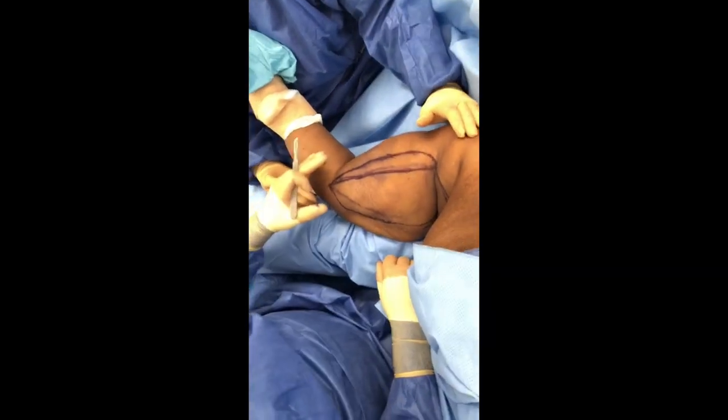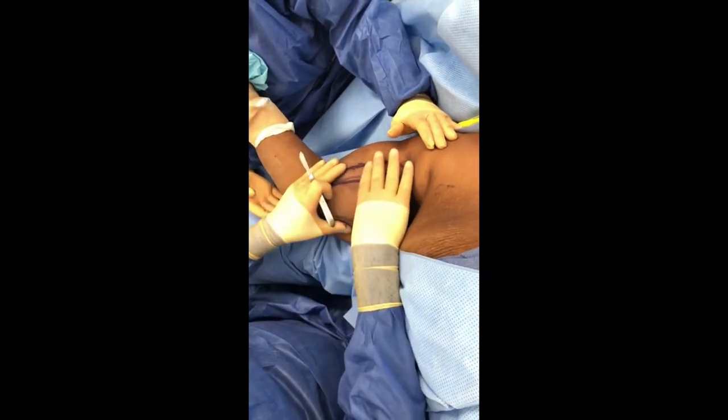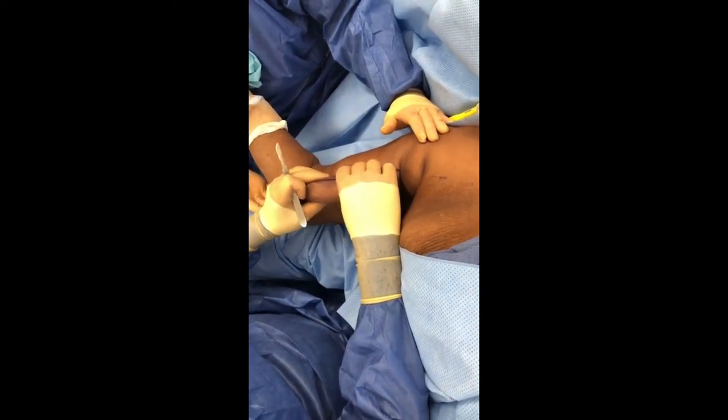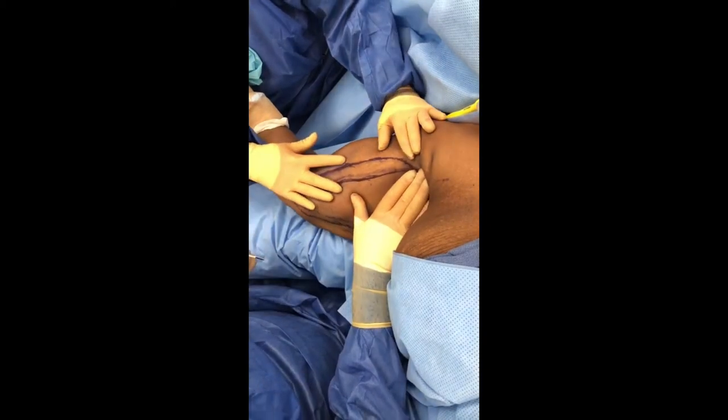Here we are with our arm lift markings. You can see this is the inside of the arm and this is the skin we're going to remove to bring the arm nice and tight like this. Now we're going to get ready to make our incision.